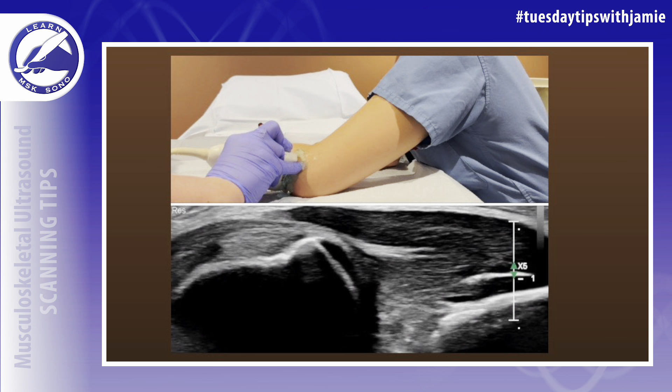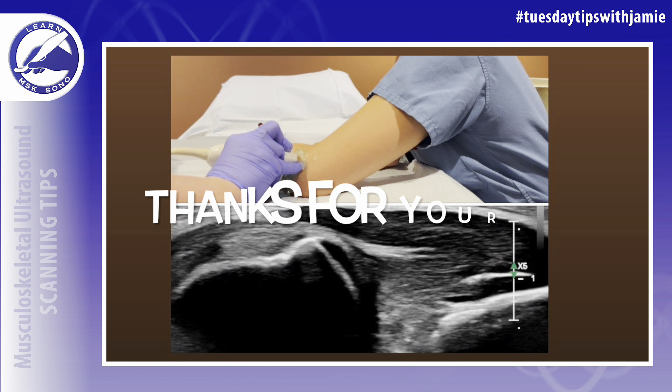This example has been on the left side, but if you understand the concept of the probe positioning, it will be easy to evaluate the ligament on either side. Hope this helped!